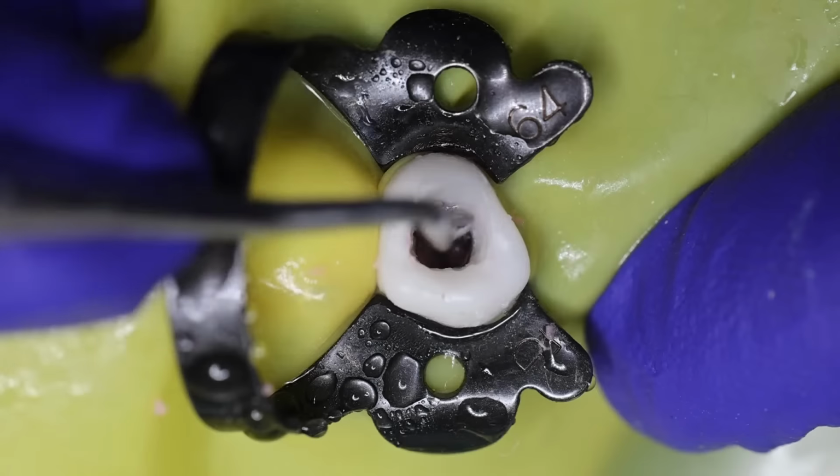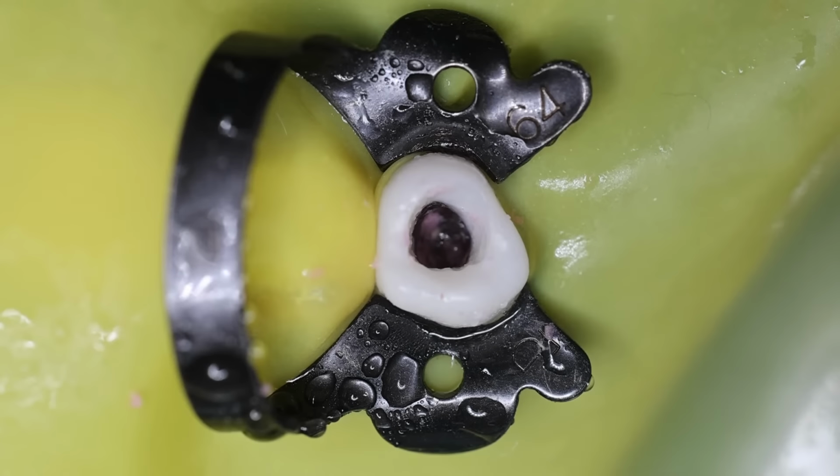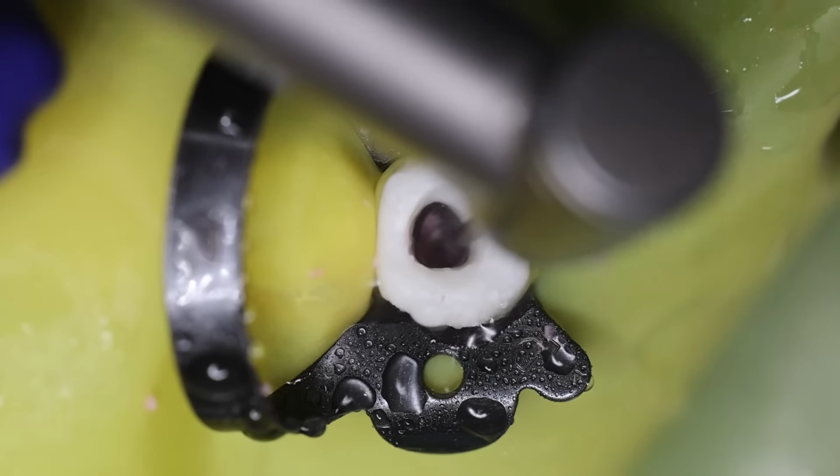This seems a little hard as this is just a simulated tooth. In a real tooth it will easily come out, so we can use the burr over here to remove it.